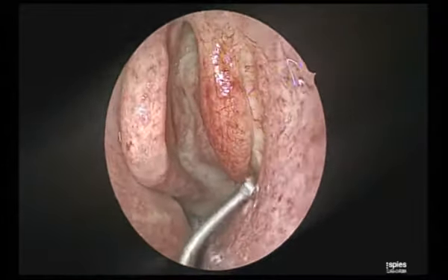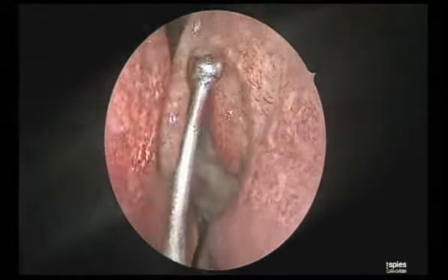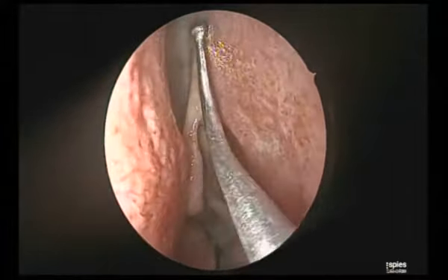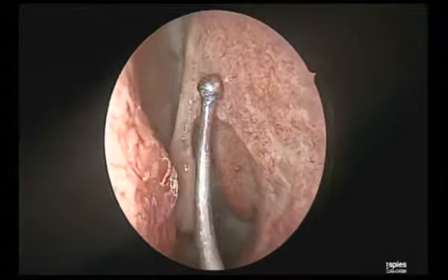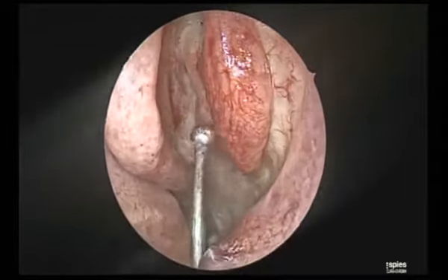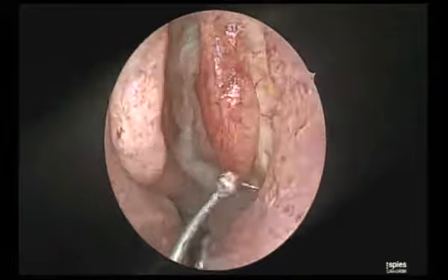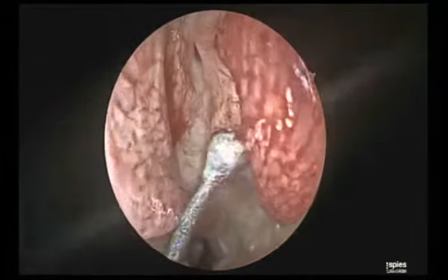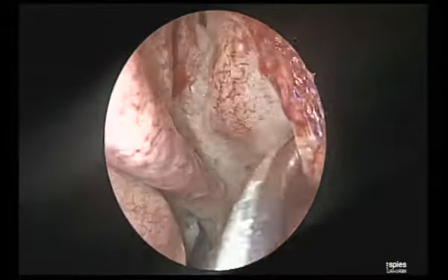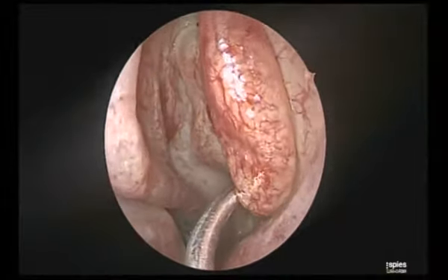Now, the important things about the surgery without wasting time. This is the uncinate process, we all know. This prominence belongs to the nasolacrimal system, and this is the agger. This is the first part of the middle turbinate, which is attached to the frontonasal process over here anteriorly and posteriorly to the cribriform, as we have seen on the CT scan, at the junction of the horizontal and lateral lamella. Now this uncinate removal is the first step in any sinus surgery. See, this is the bulla, this is the hiatus semilunaris inferioris, and this is draining, leading laterally to this three-dimensional space, that is the ethmoidal infundibulum.